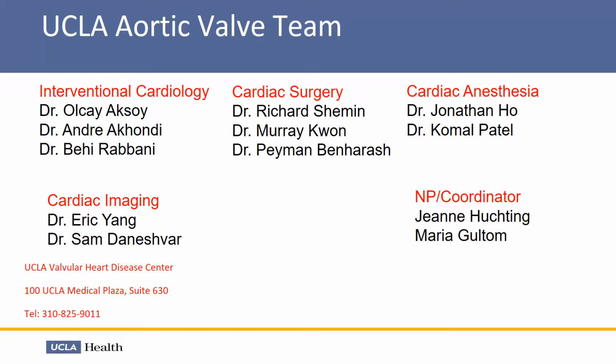I think that's what we've learned and done over the years, that we aim for 90-10, almost 100-0 in the number of cases, especially if the patient has a right bundle to begin with. And if you're going to pinch that left bundle, then we end up actually putting it 100-0, 90-10. As a result, we've had quite a few patients with bifascicular blocks, etc., and they go home without pacers. And we've been following these patients for many years now. So that's one thing.